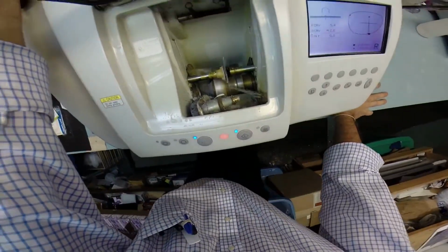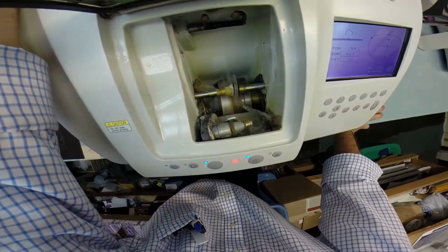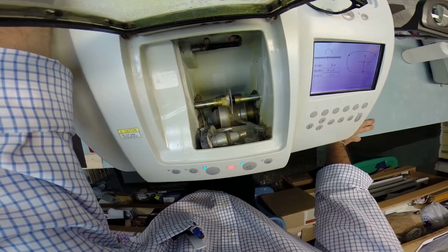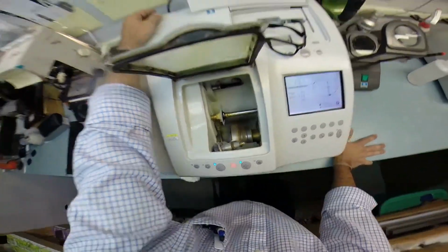So these two water jets have kicked in, one in the front and one in the side. That's just to wash away any optical debris. It does that in the last 20 seconds of the cutting cycle, which means it ought to be stopping any second now. As I said, any second now. There we go. The machine's listening to me now.